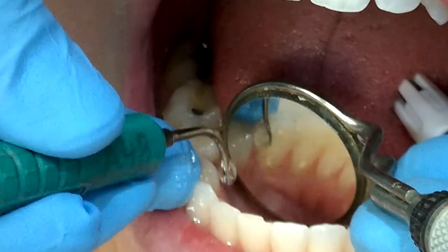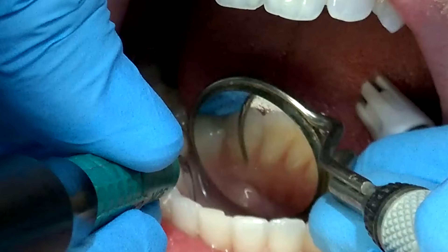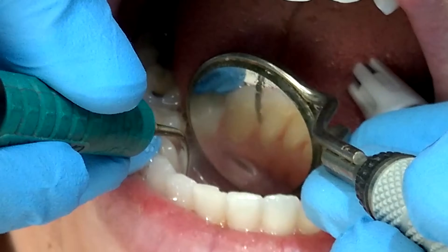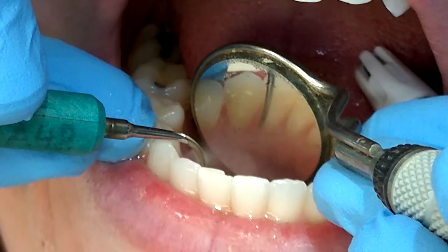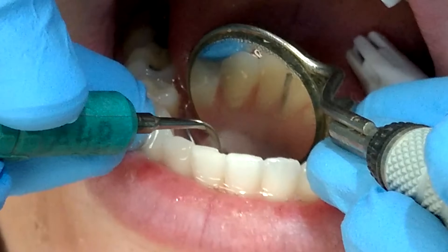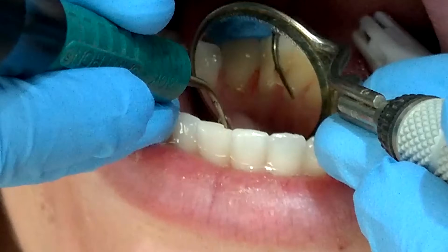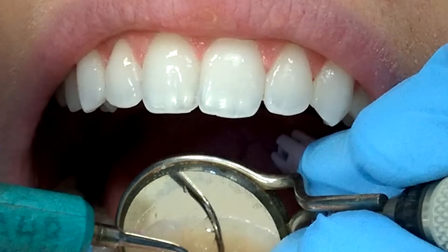We have a tendency with the lower anteriors to see all the teeth as one tooth. We get excited as hygienists once we've removed one little piece of calculus and want to jump to the next piece — but I want to encourage you to stay there until that piece is completely gone. That way you're not having to go back again. Just get it in the moment when you're there to be more effective and efficient.